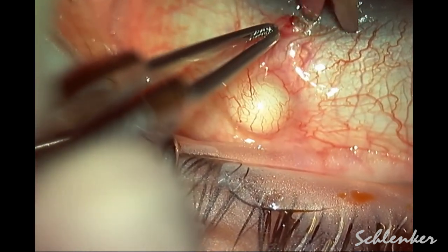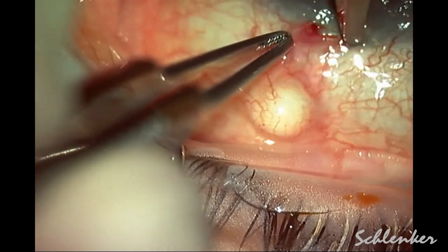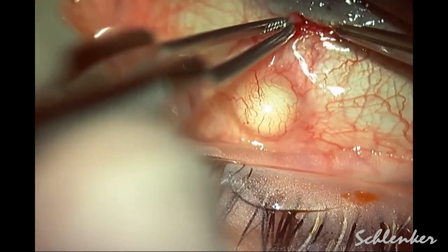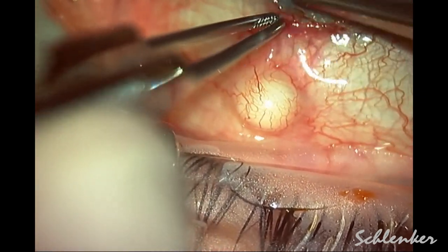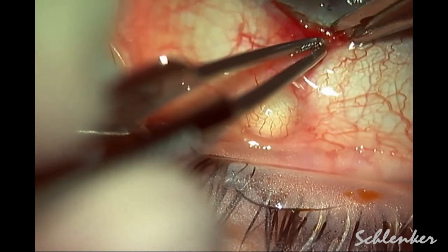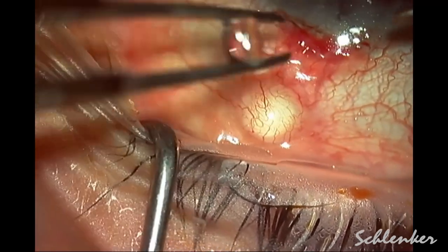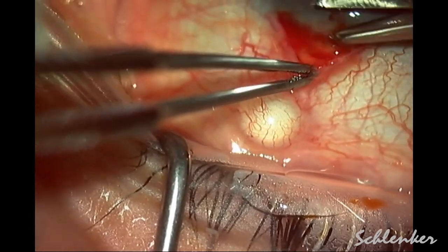I did drain this cyst and perform needling at the slit lamp, only for it to come back. The patient had a pressure of over 30 on three medication classes when we decided to go ahead and do a formal revision in the operating room.